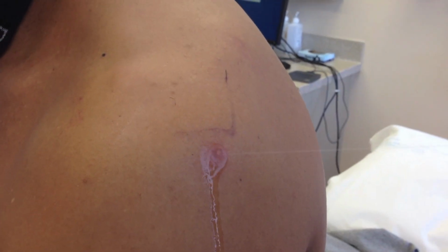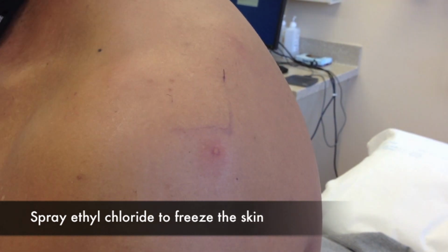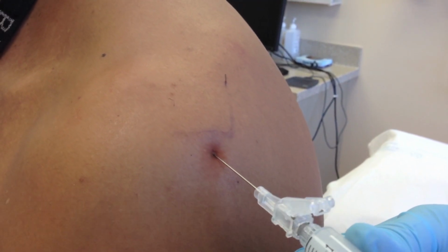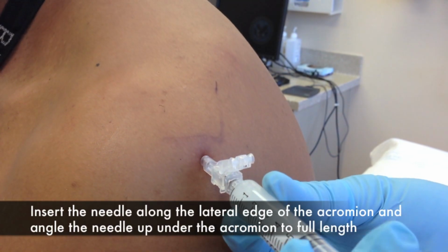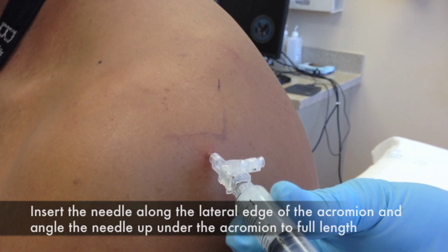To inject the bursa, spray ethyl chloride on the skin overlying your mark until the skin turns white. Just before inserting the needle, make sure to shake the syringe so that the steroid which has precipitated out of the solution can be mixed back in. Insert the 22 or 25 gauge needle quickly through the skin at the midpoint of the lateral edge of the acromion and angle the needle slightly upwards under the acromion to full length.